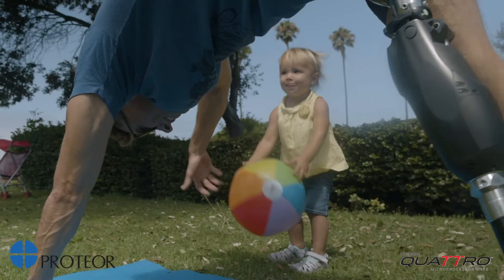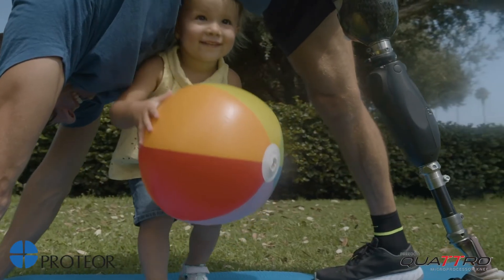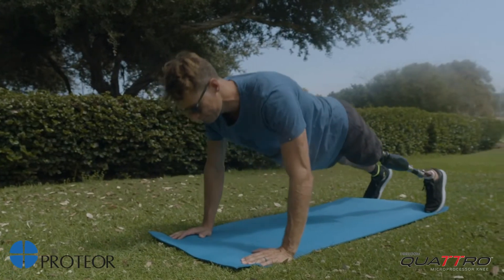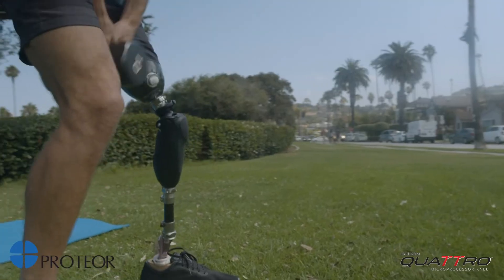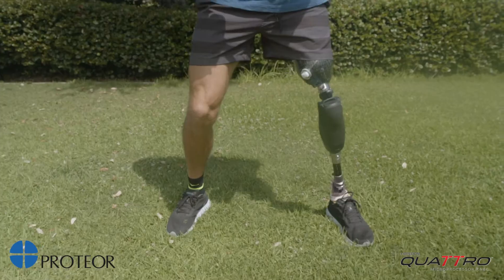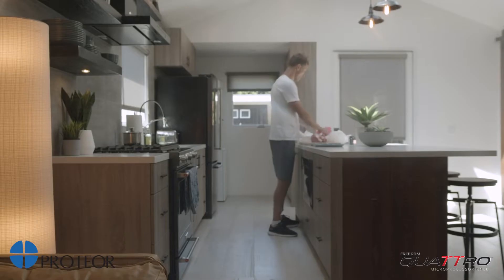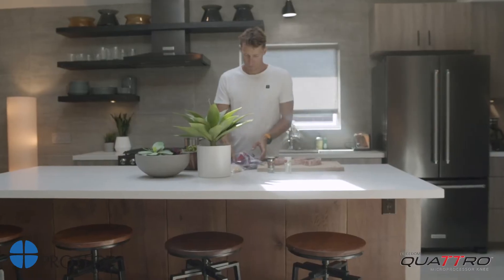Also, when I use the flexion lock, I can just keep the leg straight and locked to go on a plank or do push-ups. I've also used the golfing mode a lot for workouts, where I can just lock the knee on whatever angle I want to perform certain exercises. With the stance flexion lock, I use it when I'm doing dishes, when I'm cooking, if I'm standing on an incline, even if I'm just waiting in a line or waiting outside.